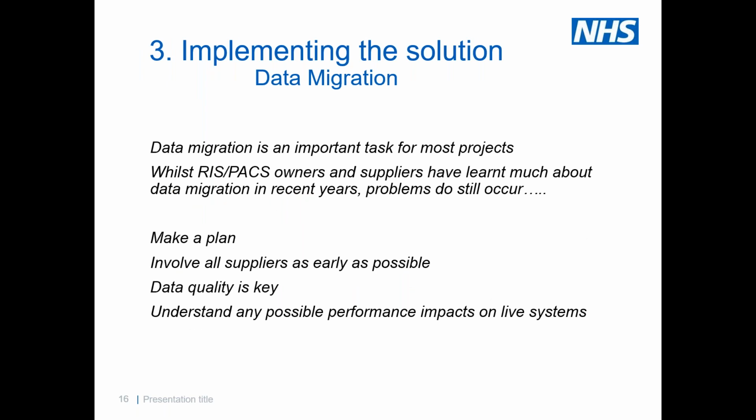The last thing on this toolkit element, on this approach element, is data migration. Data migration has caused some pain, a lot of pain in the past to people as they've changed systems. The situation is improving. Data migration is not as painful as it used to be, but it does still need thinking about. The amounts of data that we're migrating these days are very large. And the clinical safety implications of that migration process going wrong in any way are significant.